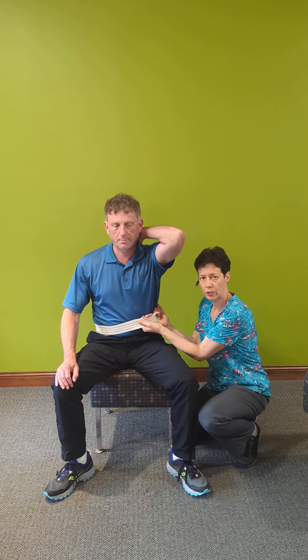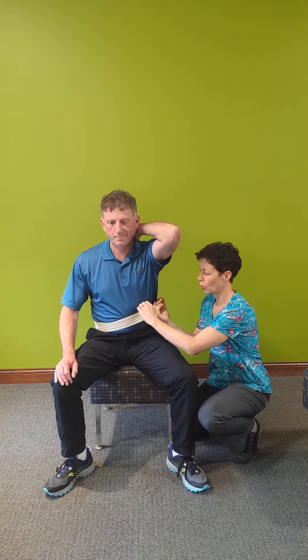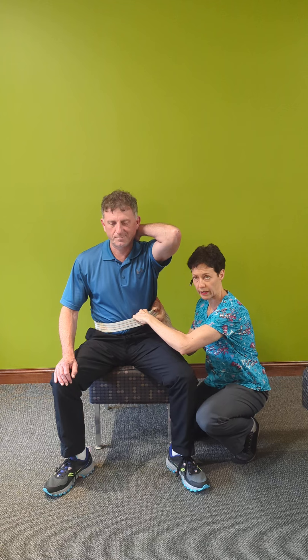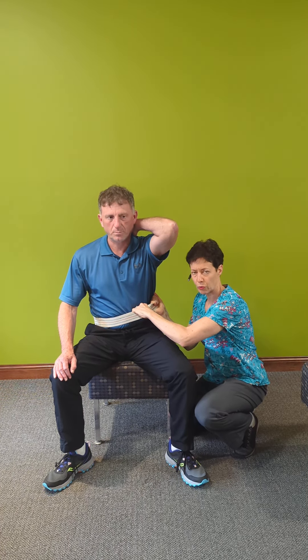There are two ways in which you can use the belt with your grip. You can have either the two-hands-underneath method, or one hand on top and one hand on the bottom. They give you a slightly different control over the patient.